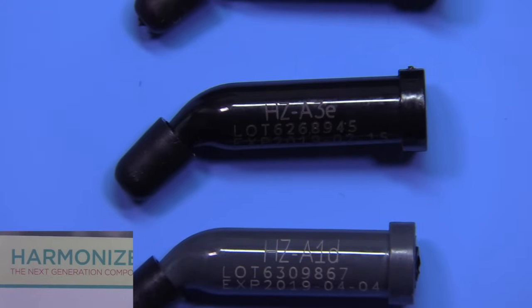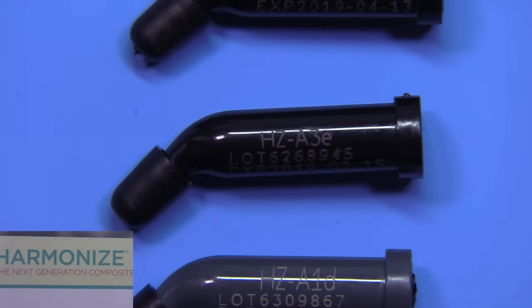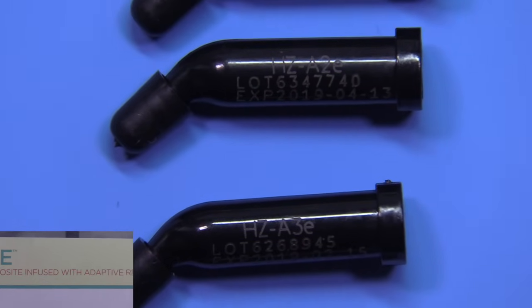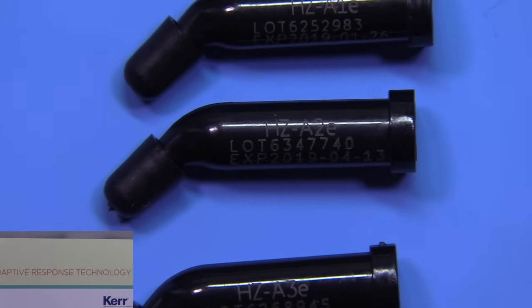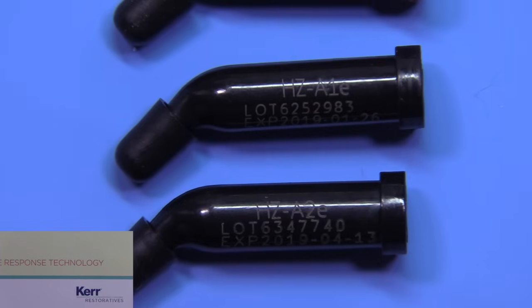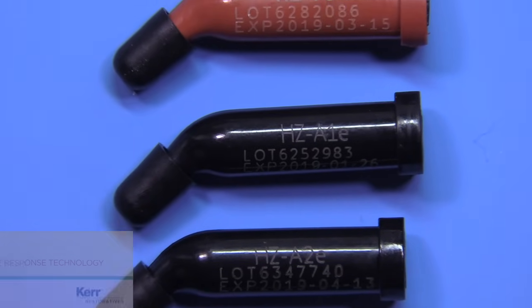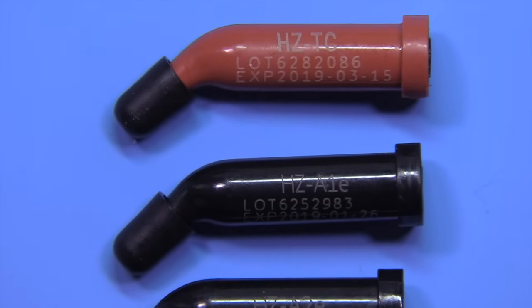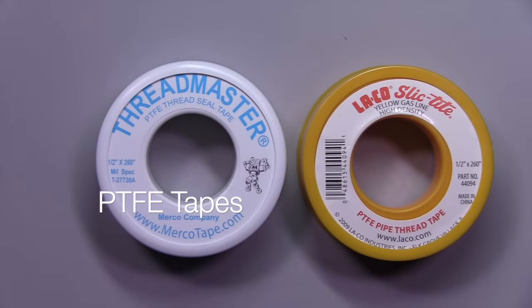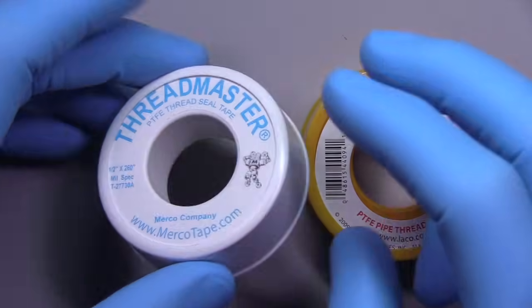Today we're going to use Harmonize by Kerr, which is a simple system — they just have enamel shades, dentin shades, and a translucent shade. I am going to challenge myself to not use 12 or 15 different shades of composite, tints, and opaquers, because for a lot of people that's just not practical.